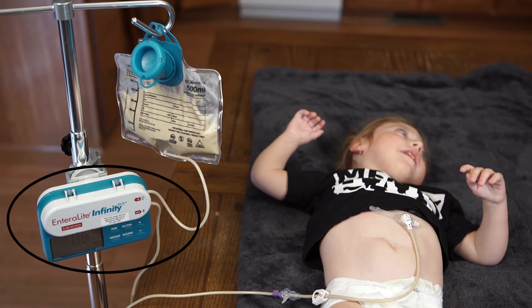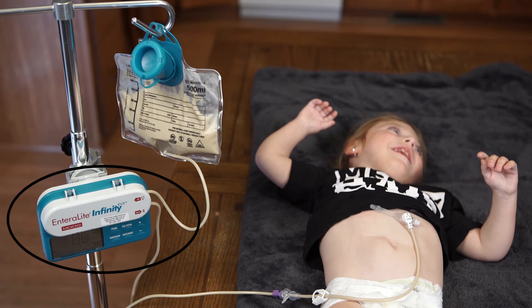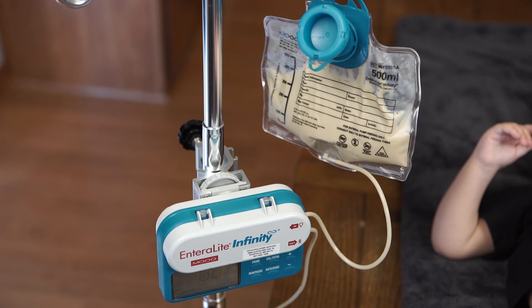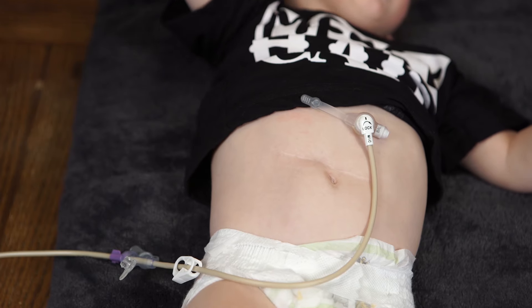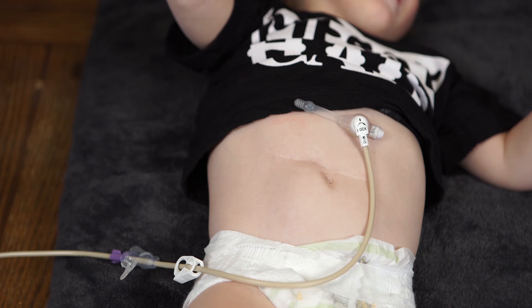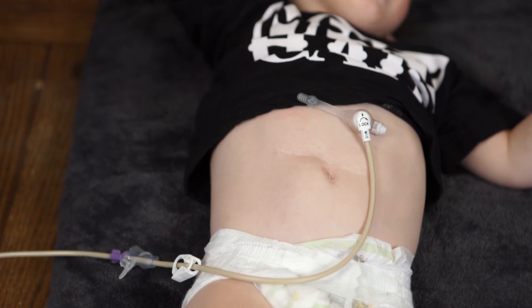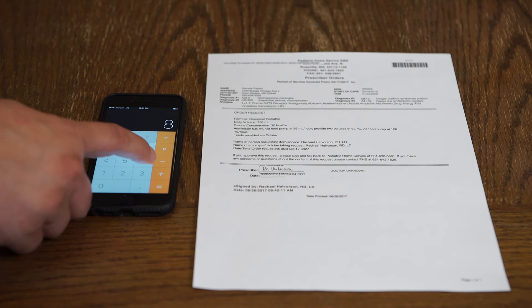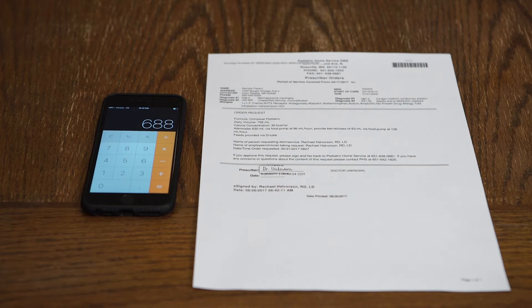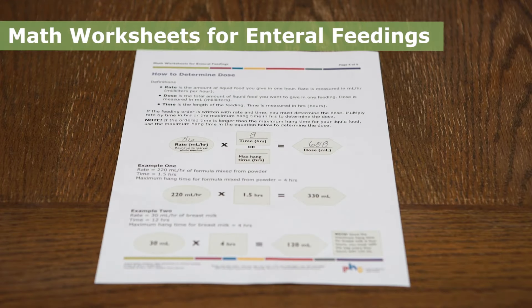This video uses an Infinity enteral food pump, which may be different than the pump you use. Always follow the manufacturer's instructions for using the food pump. This video also uses a low-profile feeding tube. The feeding tube you use with the food pump may be different. If necessary, calculate dose, time, and rate from the information in a doctor's order. Use this math worksheet if you need help with these calculations.